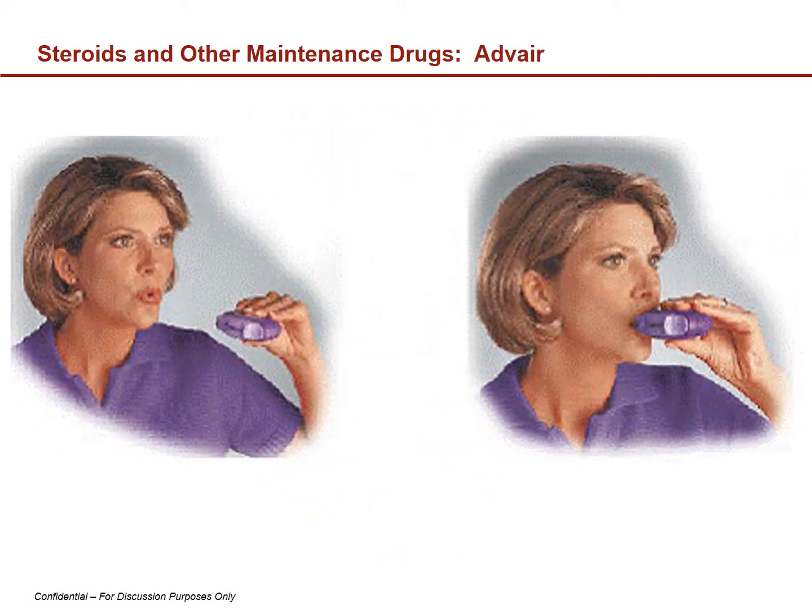The patient exhales fully, raises the Diskus to the mouth, and takes a quick, deep inhalation through the mouthpiece to pull the medication into the lungs. Patients should be encouraged to orally rinse after any steroid administration to help prevent the development of thrush.